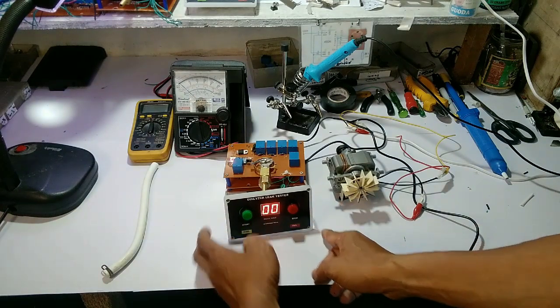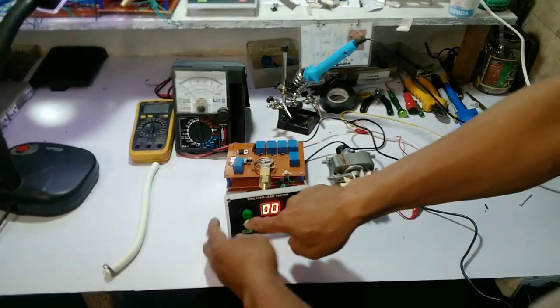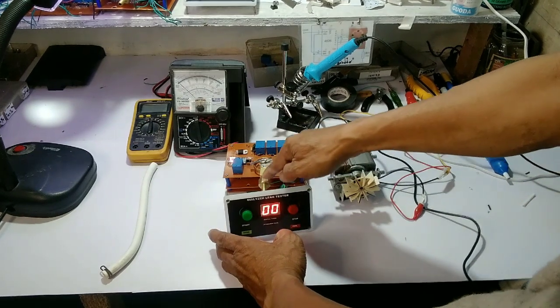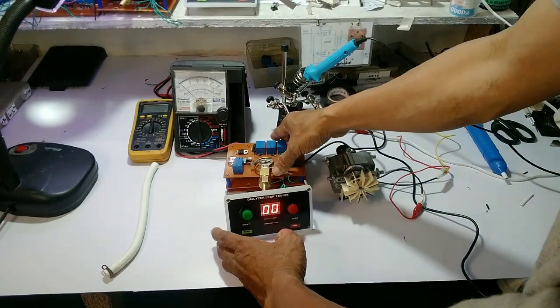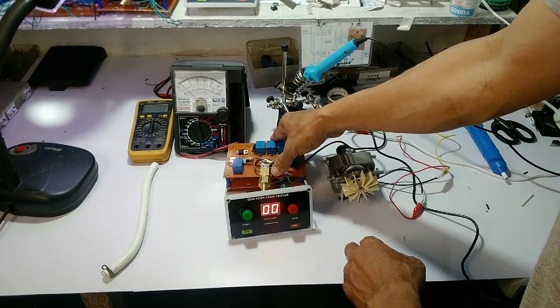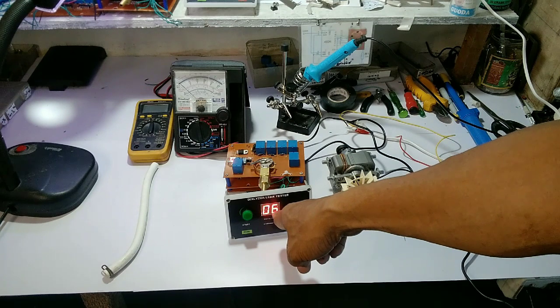Assuming na puno na ang dialyzer, aakyat po ang hangin — ang pointer ng pressure gauge — malapit sa proximity sensor. So, mabablak ang proximity sensor, magsiswitching siya at magki-start na po ang timer.